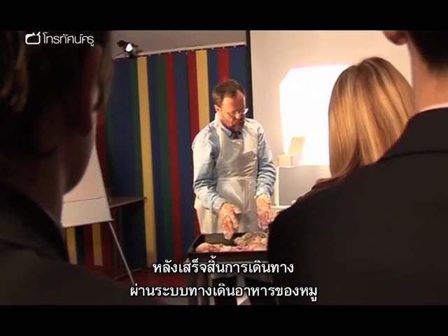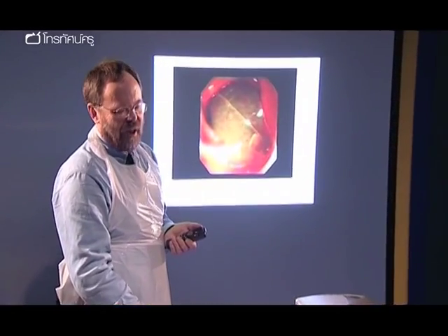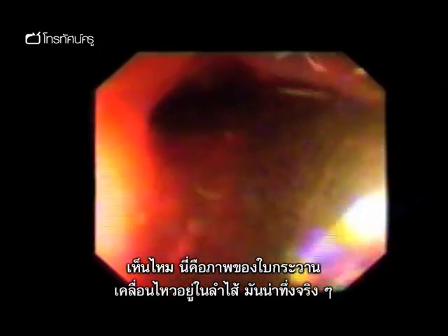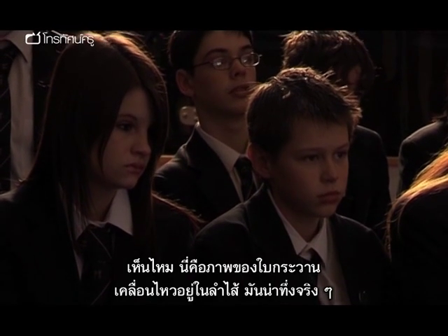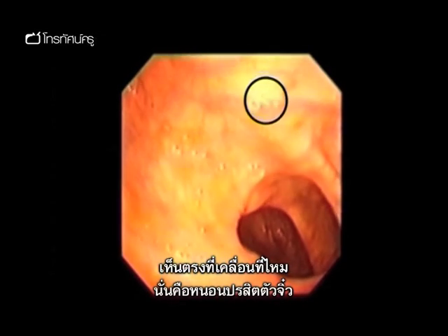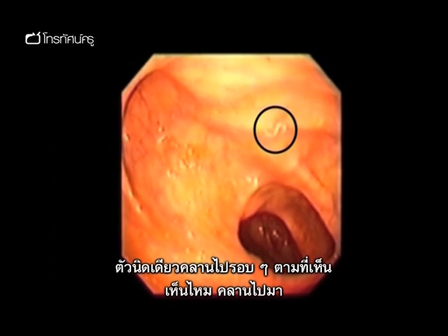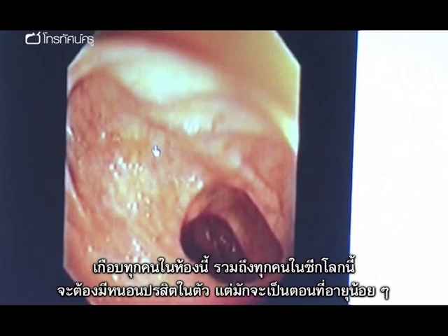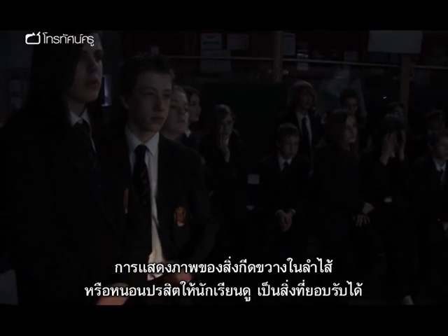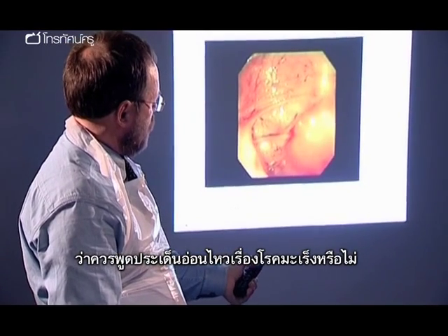Having completed the journey through the pig's digestive system, Nigel shows a few slightly more unusual endoscopy images. "If you watch carefully, you can quite clearly see a bay leaf there — I can't understand how anyone could ever swallow a bay leaf, but this person has. So there's a bay leaf actually within the colon. Watch carefully — can you see it wriggling? It's a little parasitic worm, just wriggling around. Almost everyone in this room will have had a parasitic worm in them at some point, often when you're really small."